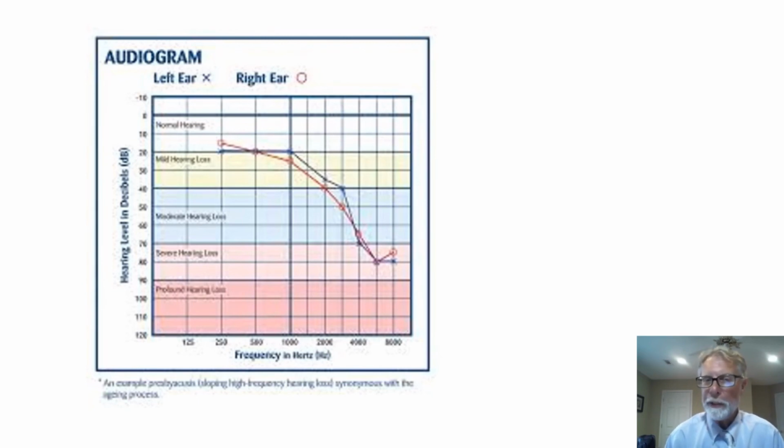And the proper hearing aid would be adjusted so it doesn't provide amplification, or what we call gain, in the low frequencies, but the appropriate amount of gain at these different high frequencies to bring them all up to within this normal area that he would hear normally.